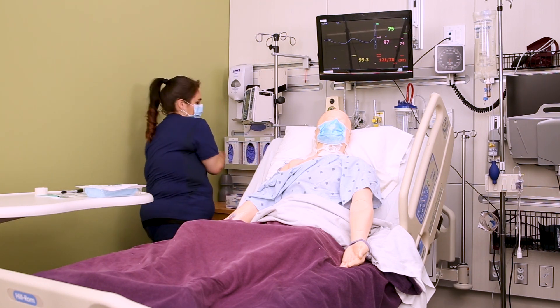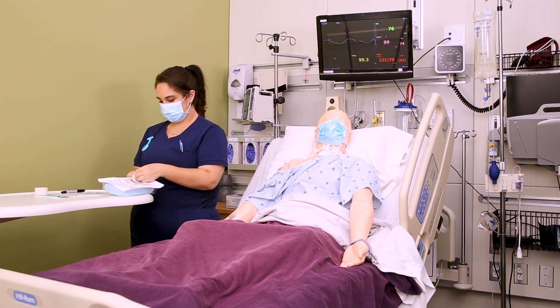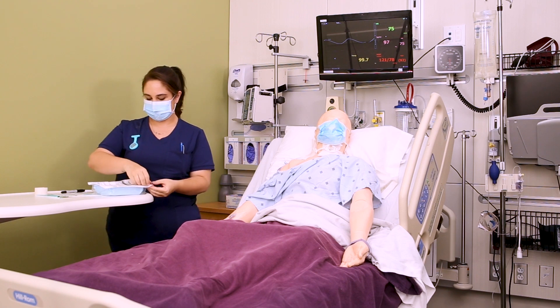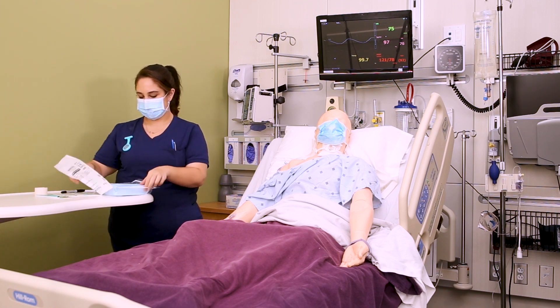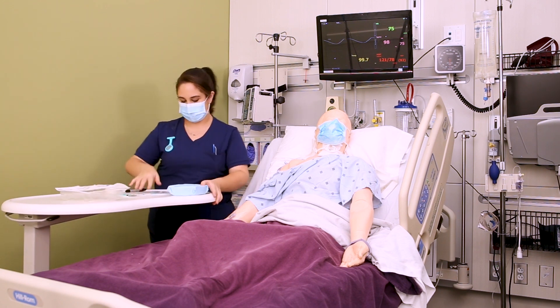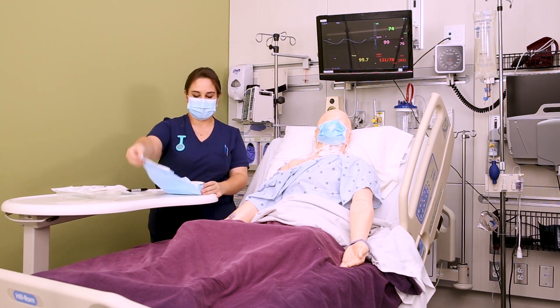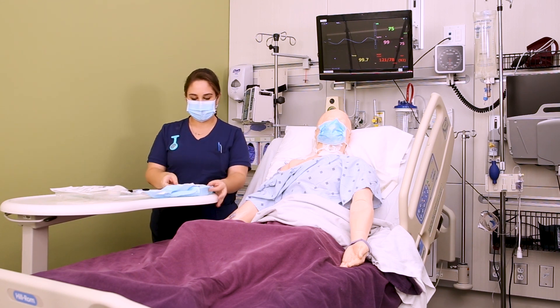Wash your hands, then begin opening your sterile dressing change kit. Most facilities have a kit for this, but if yours doesn't, make sure you have all individual supplies ready. Open the sterile kit in sterile fashion, starting by opening it away from you.